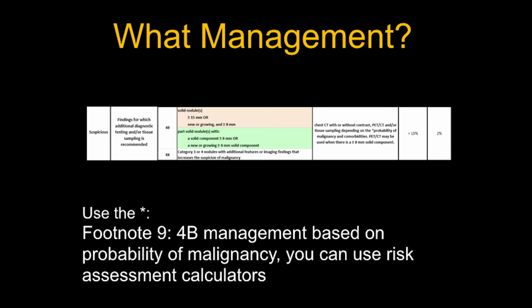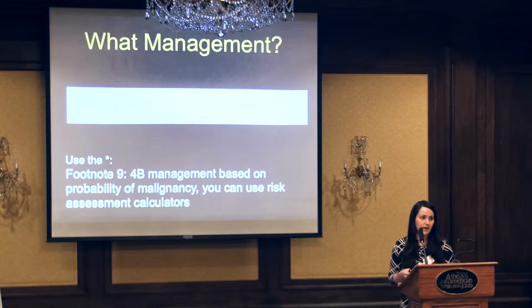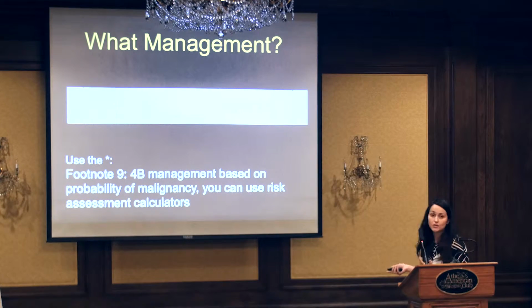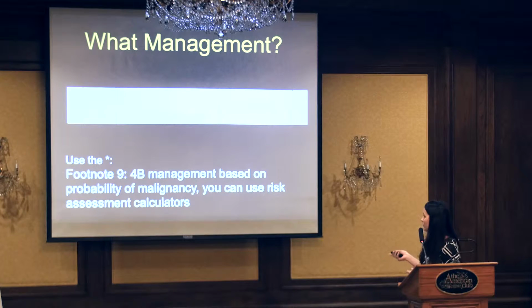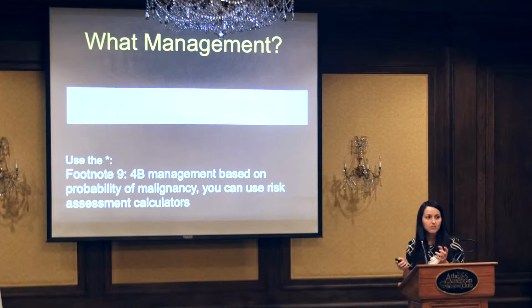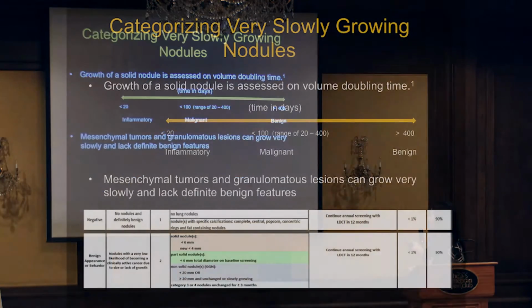So this is your way out of being a doctor and say, hey, you know what? I don't really think this is a cancer. Why don't we do something a little less aggressive, follow it up in 6 months or a year, depending on what you think. But Lung-RADS are suggestions of how to handle things, but you don't have to get stuck in it if it doesn't really make sense. And you're gonna see that as you keep using it. So the footnotes sometimes save you some time, and you can be a little more flexible than the table looks like.